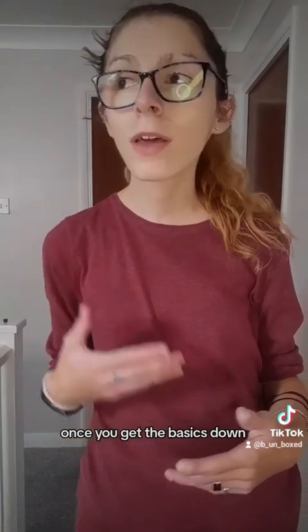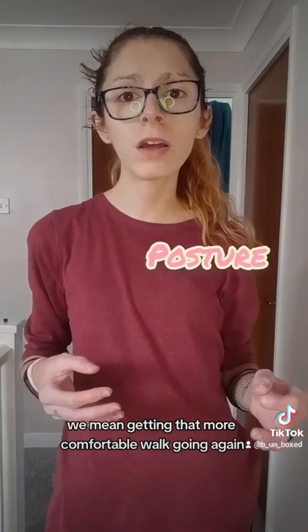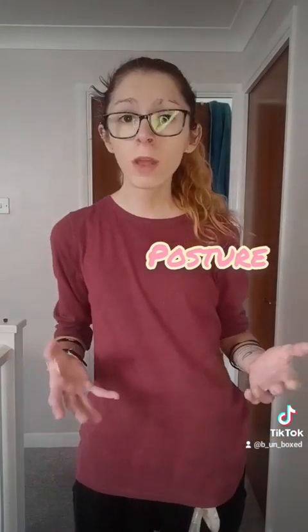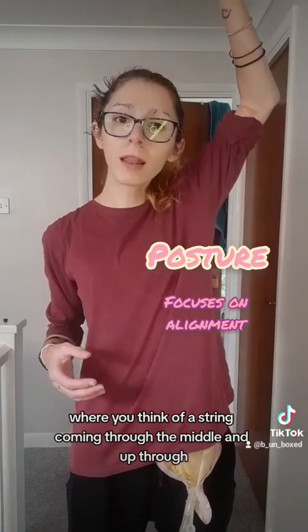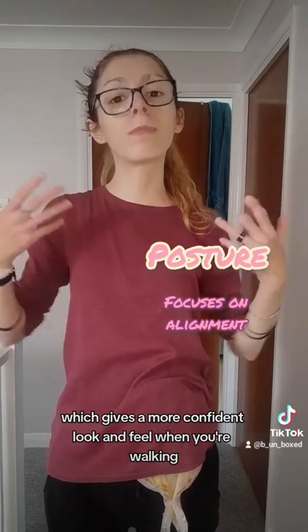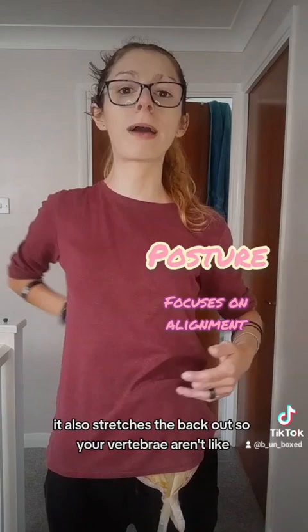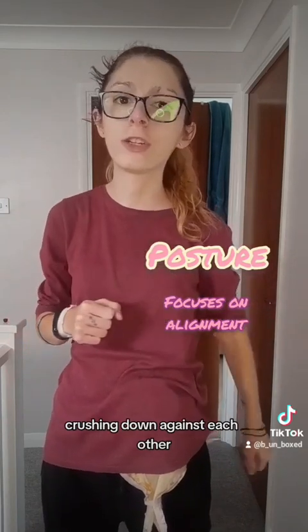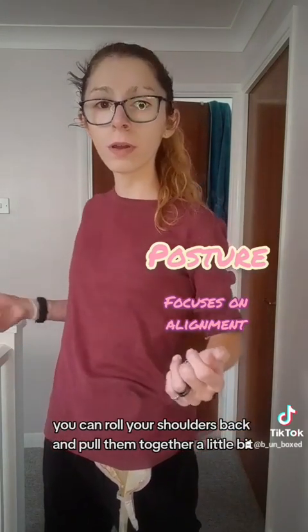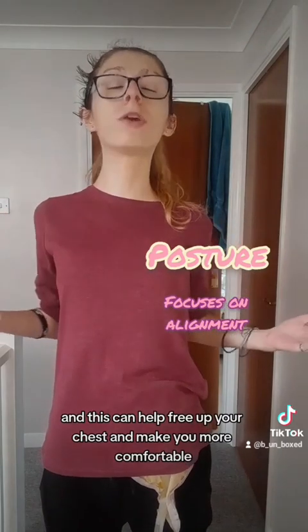Once you get the basics down, you can progress onto things like posture. What do we mean with posture? We mean getting that more comfortable walk going again. I tend to think of Tai Chi, where you think of a string coming through the middle and up through. So you lift up with your ribs, you lift up with your head, which gives a more confident look and feel when you're walking. It also stretches the chest out so your vertebrae aren't crushing down against each other — that helps make you more comfortable. You can roll the shoulders, pull your shoulder blades together a little bit, and this can help free up your chest and make you feel more hopeful and more confident.